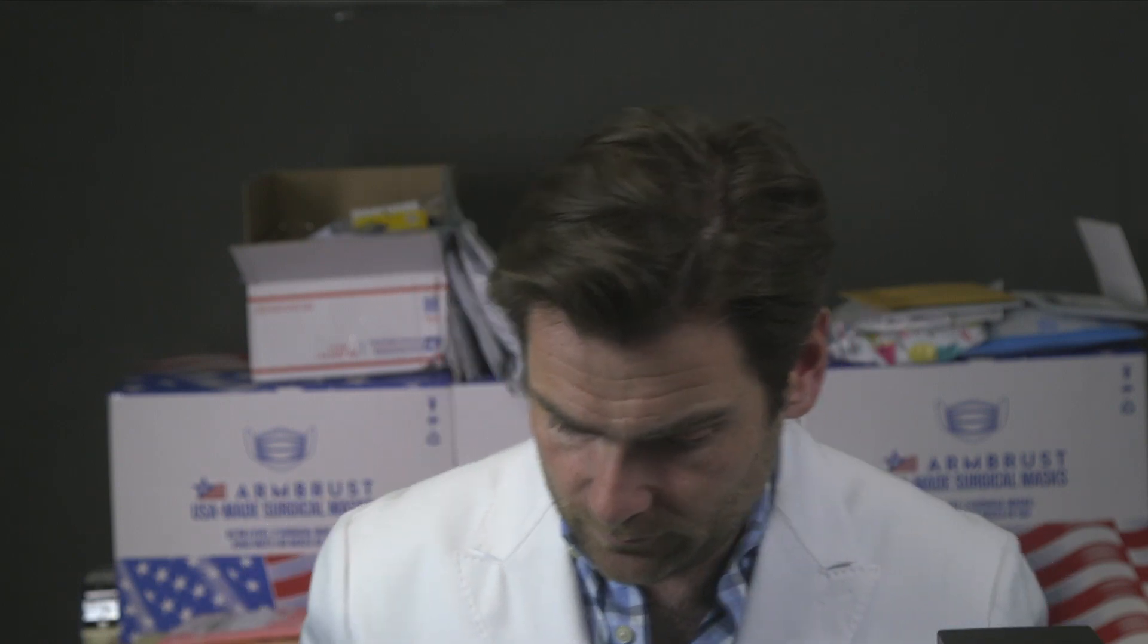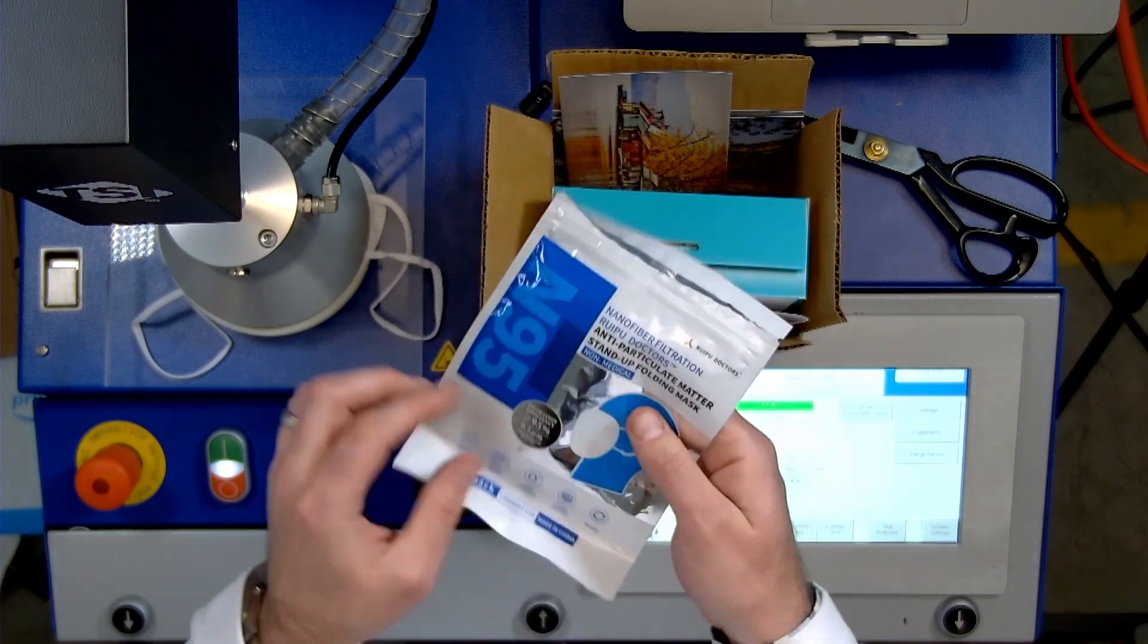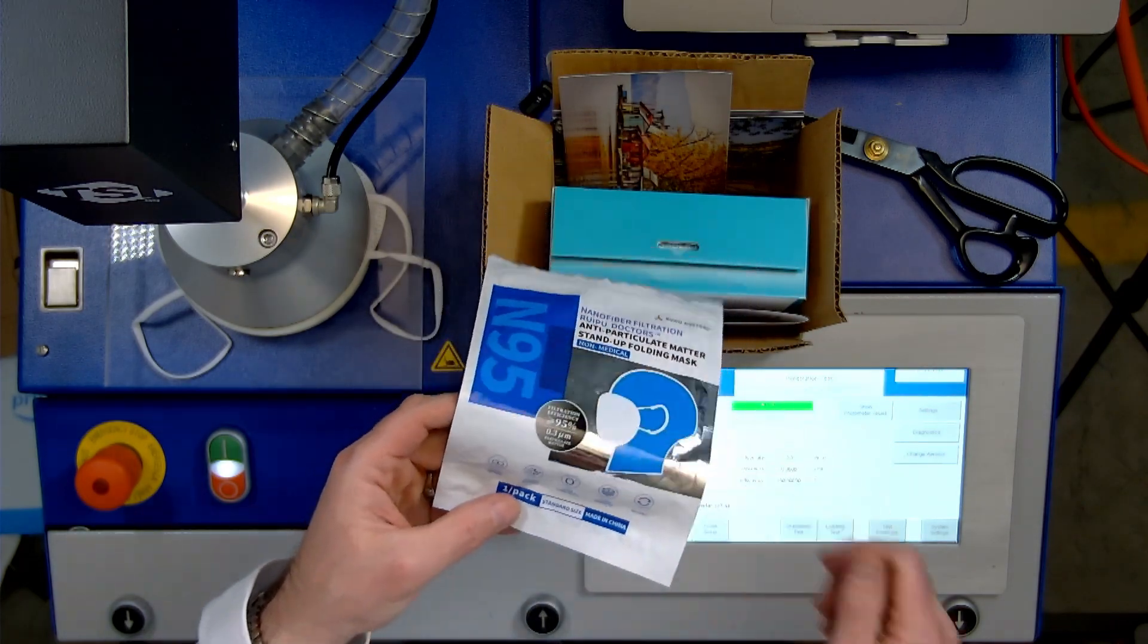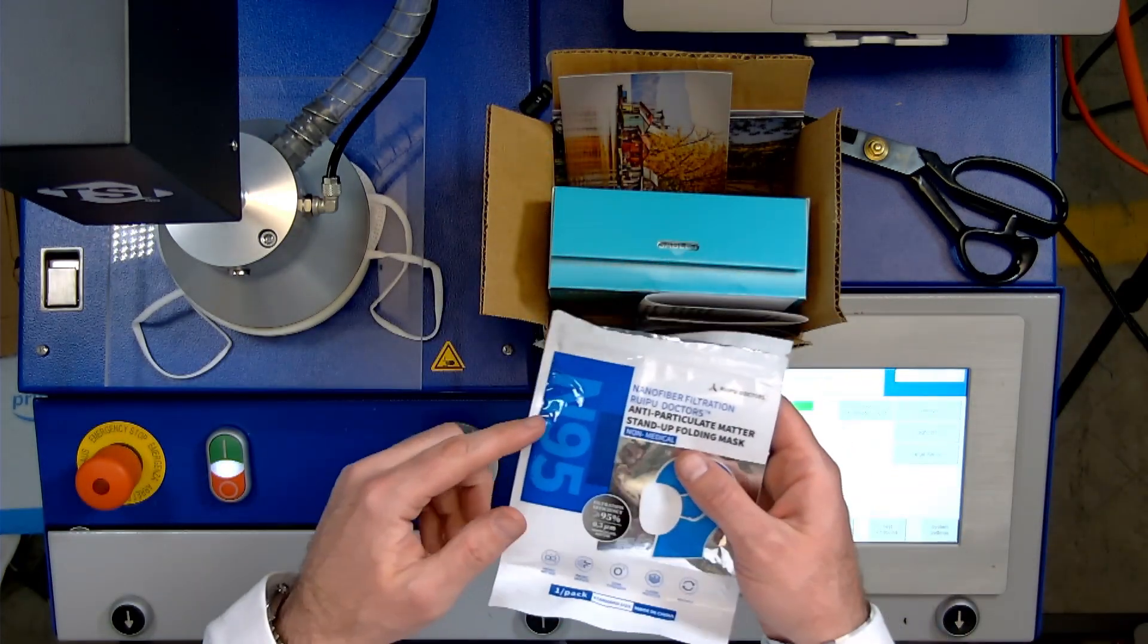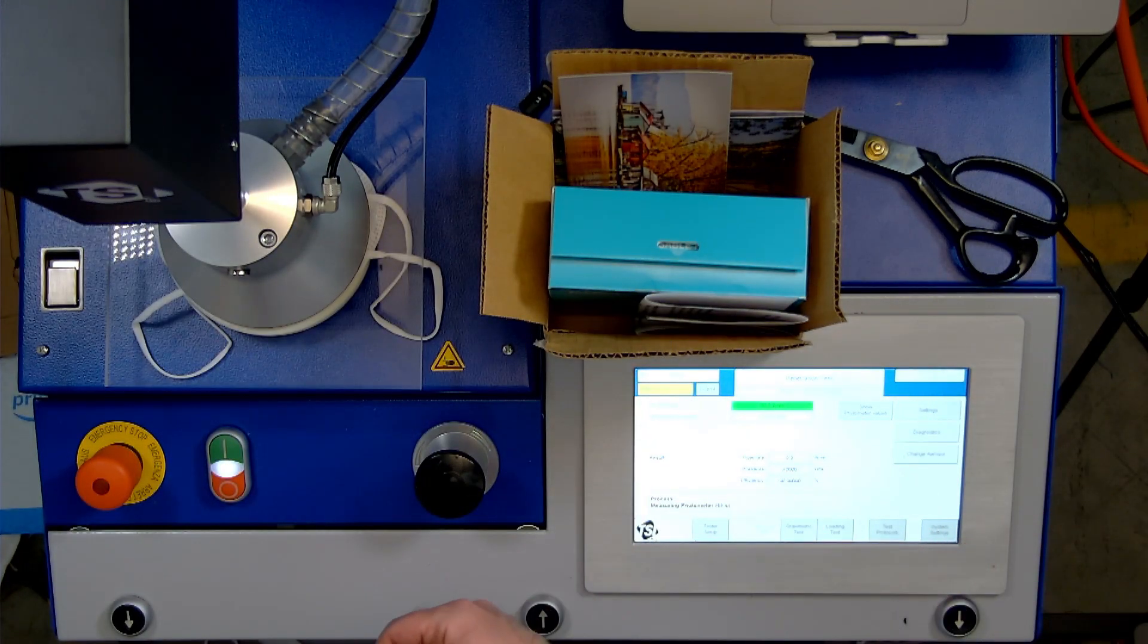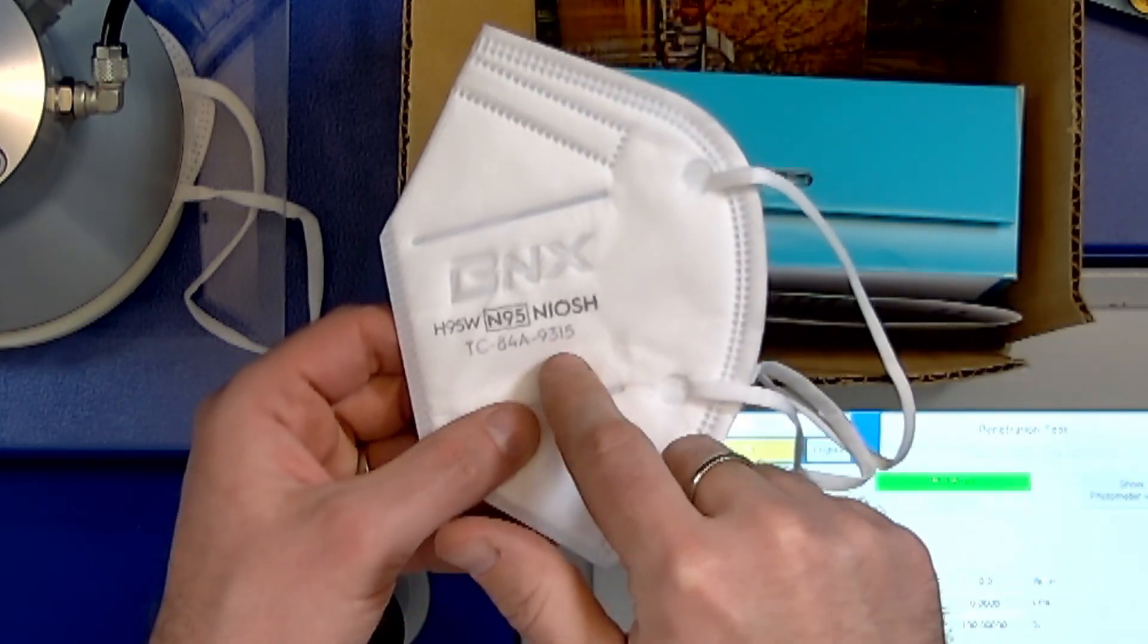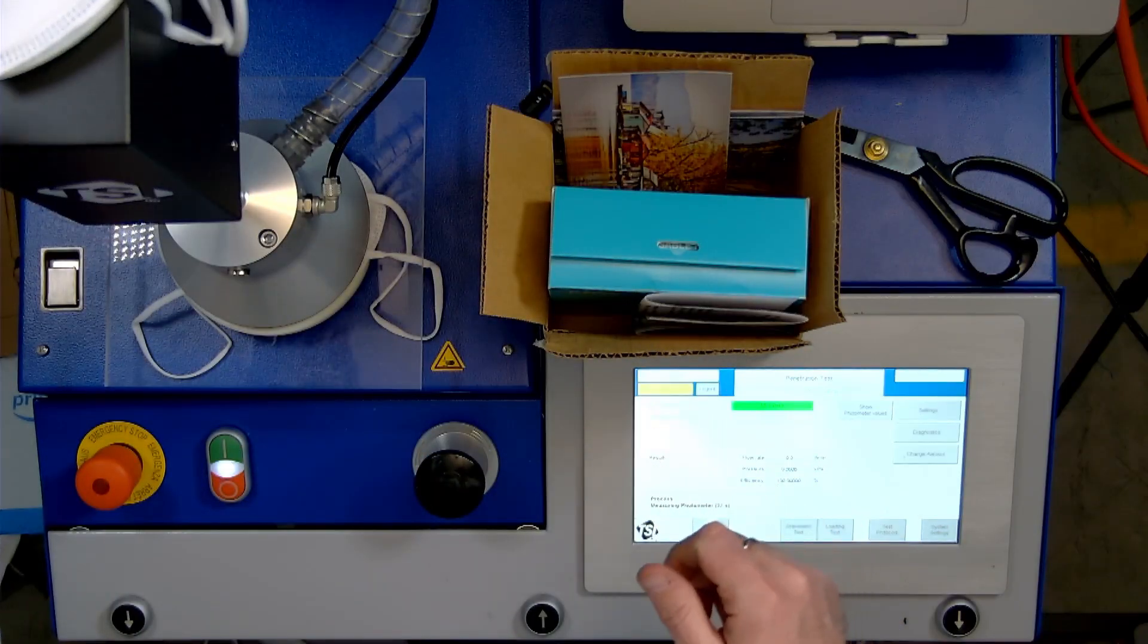So this says it's nanofiber, which is probably not. And it says that it's an N95, which it's not because it doesn't have the correct markings on it. You need to have a TC number like this, TC, on the actual mask if you want it to, if it's an N95.